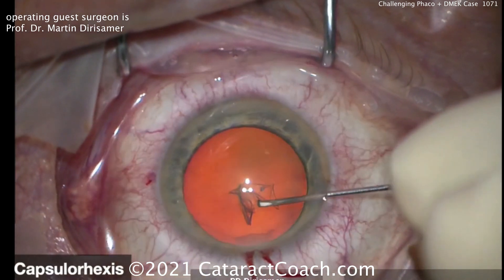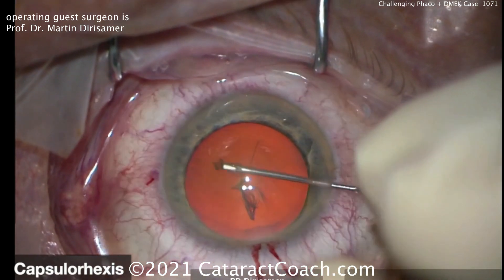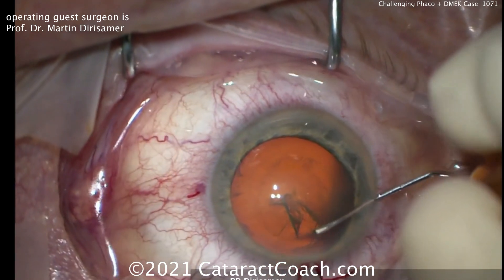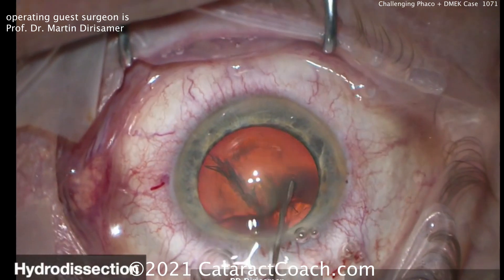Starting off the cataract surgery now, doing a capsulorhexis here. In these eyes, don't make an overly large capsulorhexis. You want about a 5mm capsulorhexis at maximum, maybe even 4.5mm in diameter, because you really want the capsulorhexis to hold the IOL optic in position.